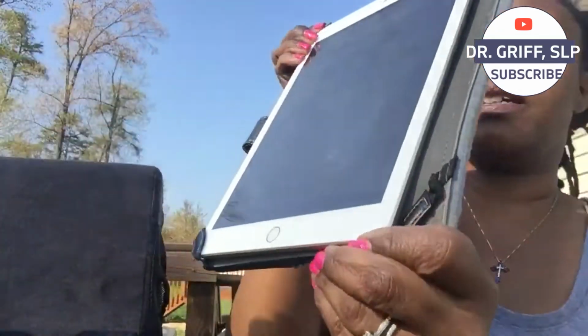Here we have our bubbles. Let's see. I'm going to adjust our camera so you can see our bubbles. I'm taking my assistive technology off of its stand. And we're going to see if we can open the bottle of bubbles.